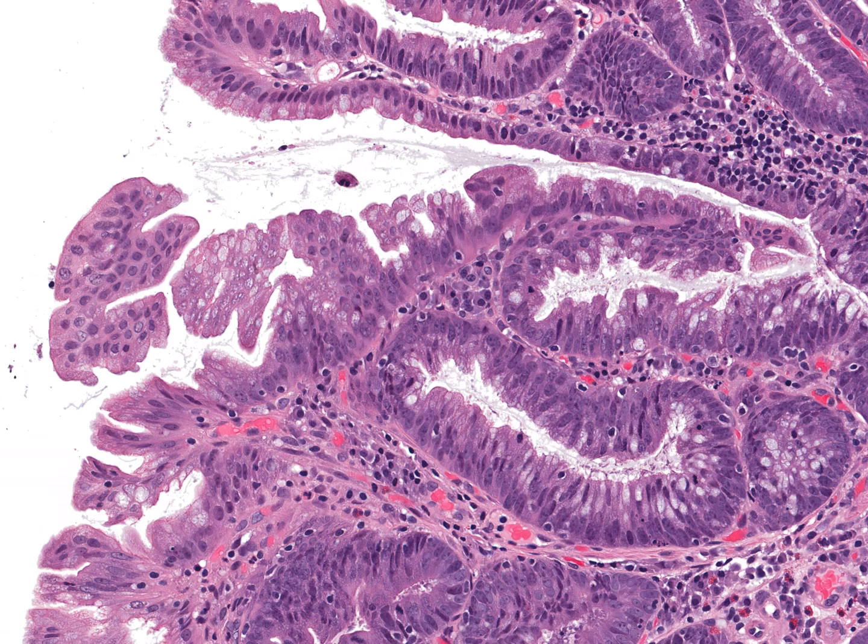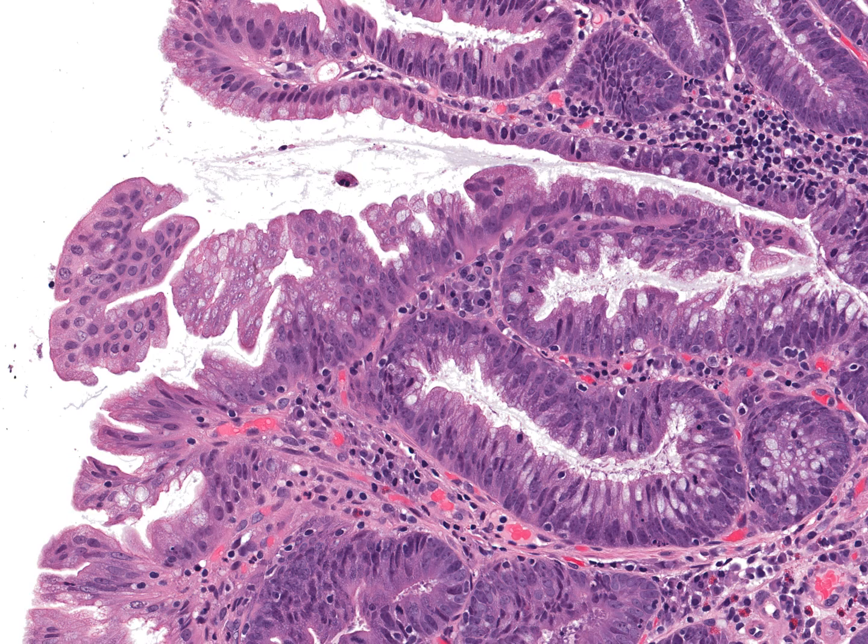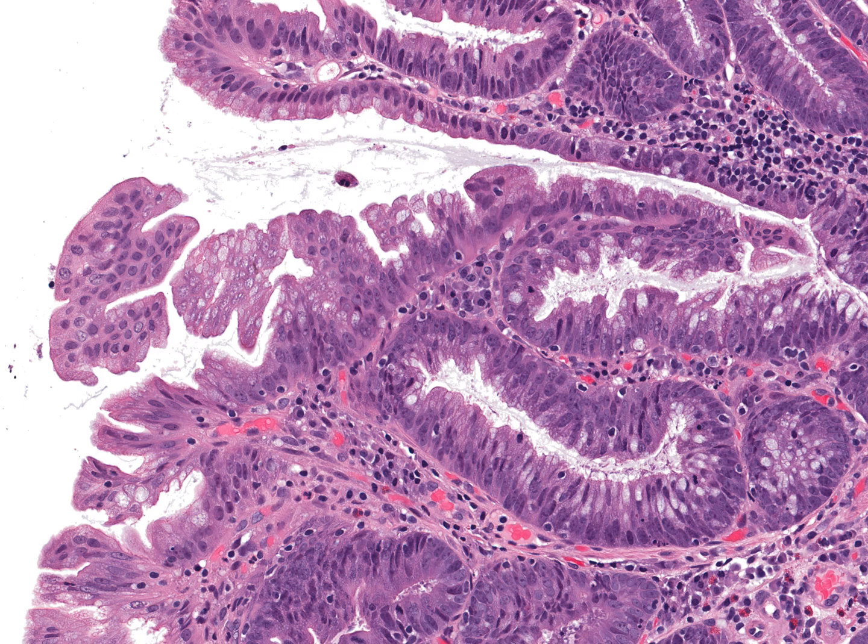Conventional dysplasia has arisen in the sessile serrated lesion. These lesions are not common, since it is thought that there is rapid progression through conventional dysplasia to carcinoma.